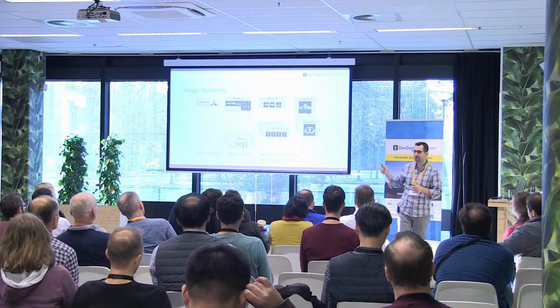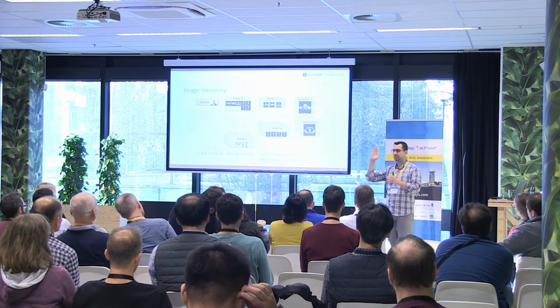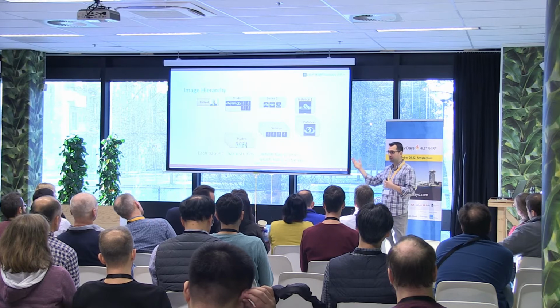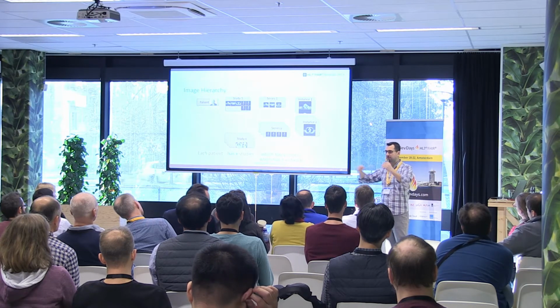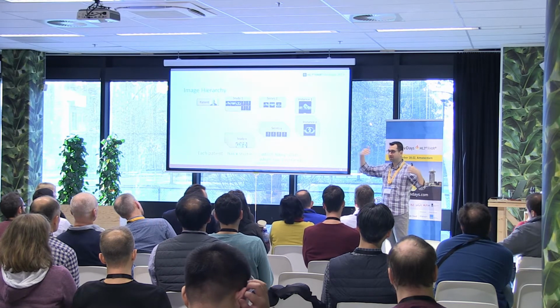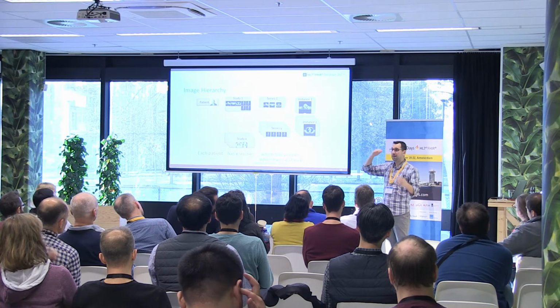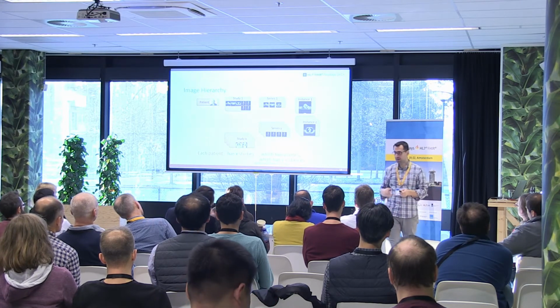So taking the example of a hand, your instance could be one view like this, one view, for example, like that, and so on and so forth. If this is a CAT scan, as you know, CAT scan is basically image, image, image, image. So you usually end up with anywhere between 200 and several thousand images in one shot. So these are your instances within DICOM.